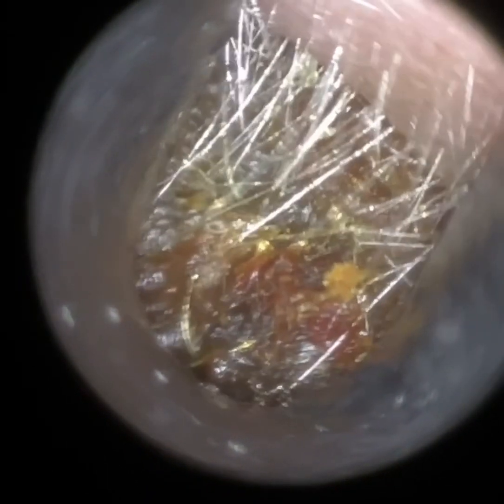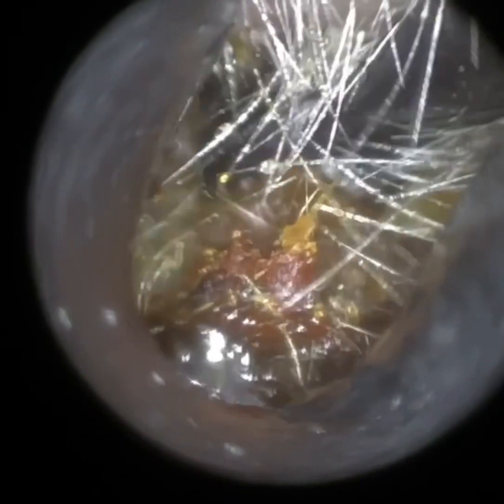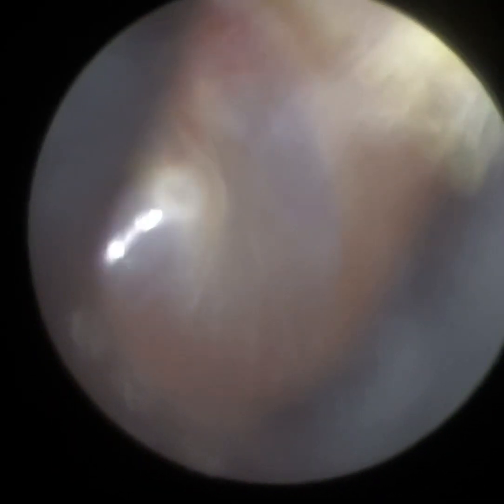Now, just as with the right ear but more so in this ear, this wax plug has got trapped near the entrance. We've loosened it and mobilized it, so I'm now going to insert a Jobson horn. This is where the Waxscope has additional advantages, because it's not just microsuction — with the Waxscope you can use the full range of ENT micro instruments. You can see how we're using the Jobson horn to get in and behind this wax plug and slowly bring it forward. Even with a small speculum there's enough space and maneuverability to insert all instruments.